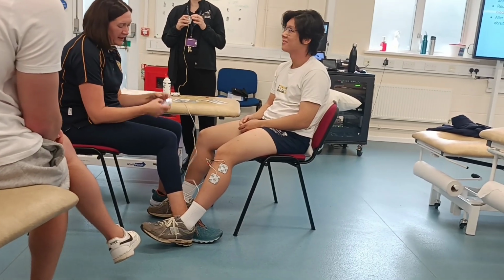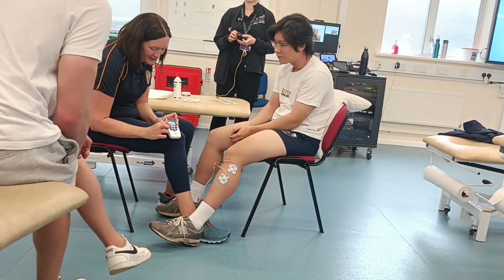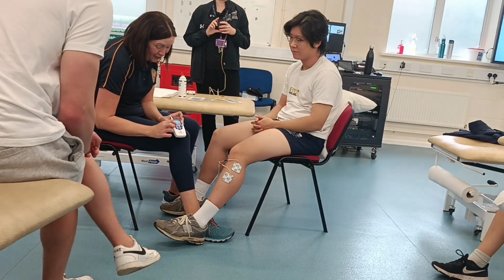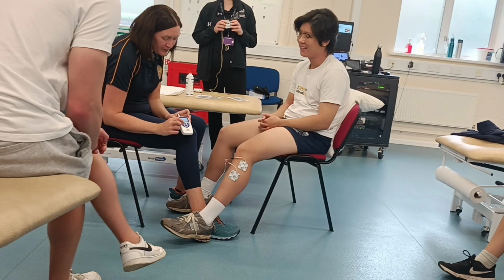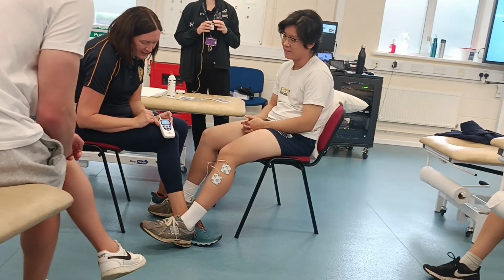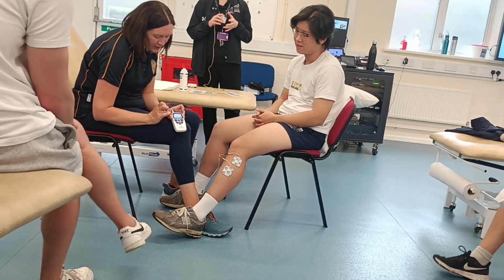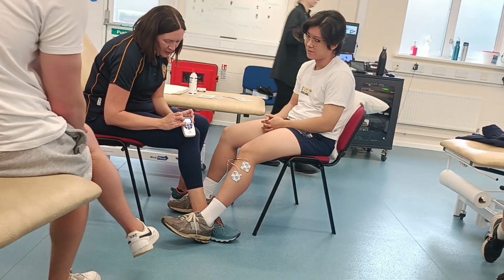Oh yeah, we're going now. So this one, the intensity is going. We're on 7, 8. It must be able to show. They are cheaper electrodes. There you go. Okay. So yeah, can you feel a bit of a tingle? Yeah. It's on. And it's going to go off in a second. It's on for 10 seconds. It's off for 10 seconds. The little arrow is down to tell me it's off. It's going to flip up and go on. And then when it's on, I'm going to turn it up more.